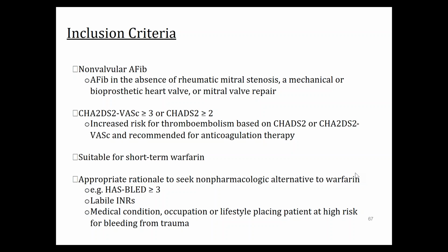That is changing, and that was the FDA mandate initially, because in the practicality of scheduling and doing these randomized controlled trials, the death of this device was going to be clots. If they had more strokes with this device than warfarin, it was done. So they were extra cautious in ensuring that the device didn't have any clots form on it, so that they didn't have a stroke not related to this while it was being studied.